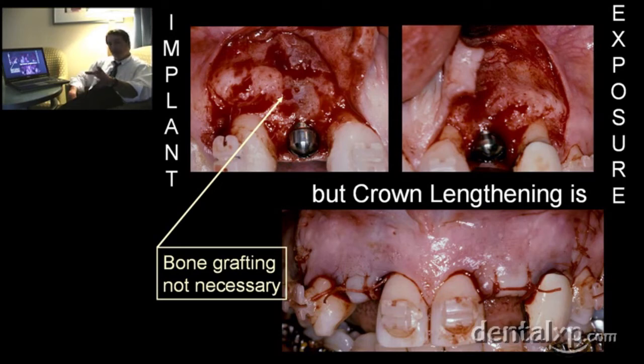But at second stage of surgery, I also don't want to lose the opportunity to move that soft tissue from the palate labially. Moving that tissue from the palate to the labial is a way to do a connective tissue graft without having to go to the palate and get connective tissue. And it's an area where a lot of surgeons miss the opportunity. They'll do a punch technique, they'll do a mid-crestal incision. All you have to do is move that scalpel 4 or 5 millimeters to the palate, even further if you want, as long as you don't go down into the rugae, and take that tissue and roll it labially.